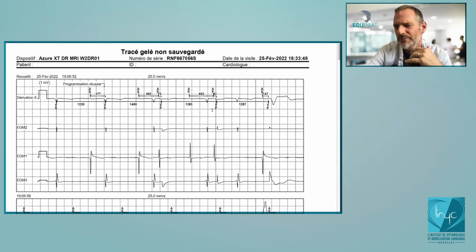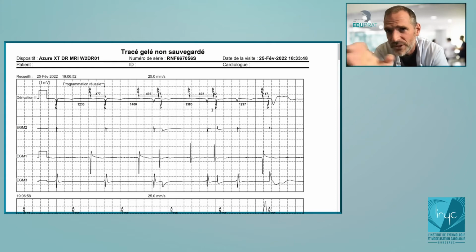So if in a patient with sinus dysfunction you know there is no obvious AV block, but you see many episodes from AAI to DDD, what you can suspect is a problem of loss of capture at the level of the atrium or a problem of ventricular undersensing. Okay, so when I interrogate a Medtronic device, if I see many episodes of switch from AAI to DDD, one of the possibilities is that there is a problem of atrial capture or ventricular undersensing. Is this clear for everybody?